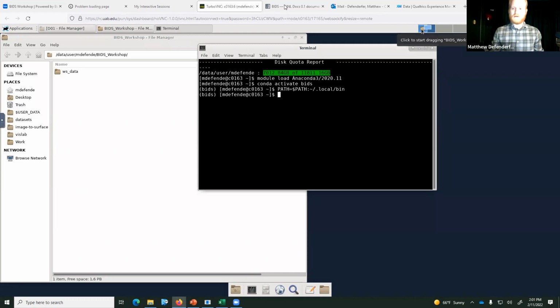Chat. Okay. So at this point, there's a question. So give me just a second. Let's say you have NIFTI files, but not DICOM files, but you need to put your NIFTI files into BIDS. When you run the HeuDiConv command, do you just put the path to the NIFTI files for the /d command? That's a very good question. I have not actually gone through and tried to convert non-BIDS NIFTIs to BIDS NIFTIs.